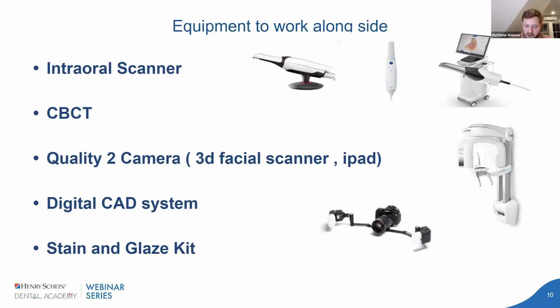Cone beam, again, I have 3 of them in 2 offices. I have 2 in 1 office just in case one goes down. I use it day in, day out. For diagnosing and doing implant dentistry, I can't live without it. And if you want to get into implant planning or doing surgical guides in your office, you're going to need a cone beam. You can't do it with a pan.